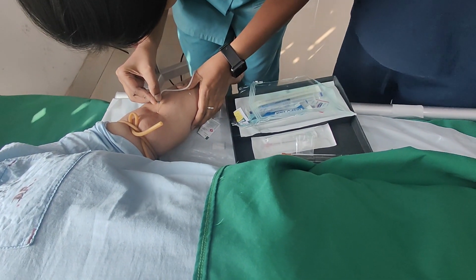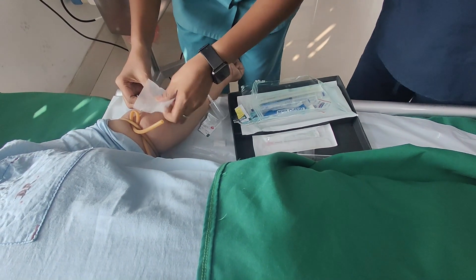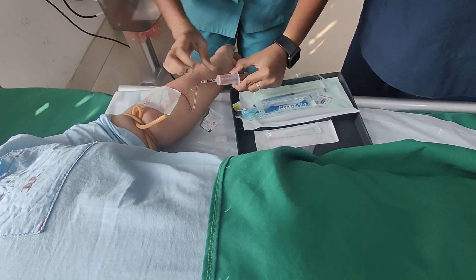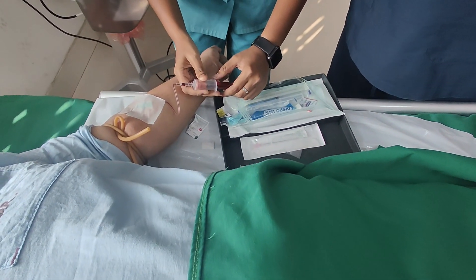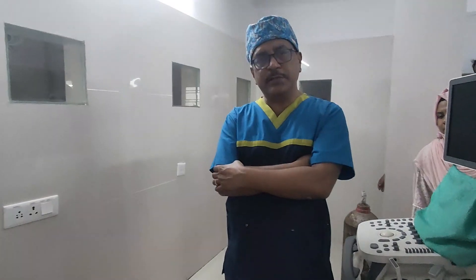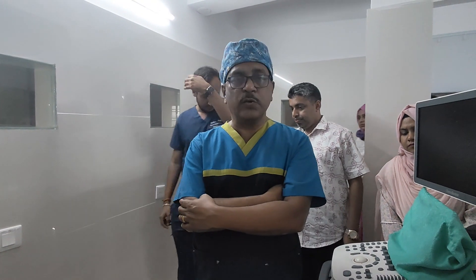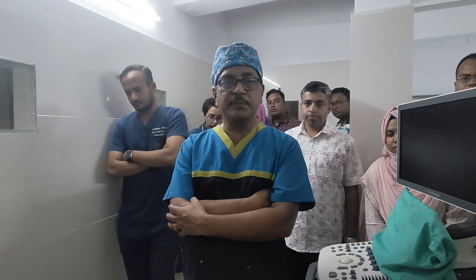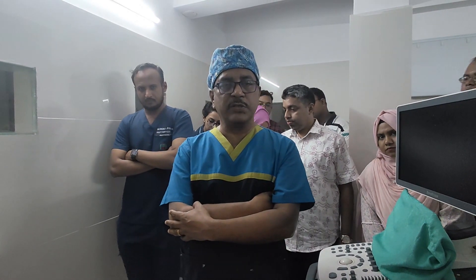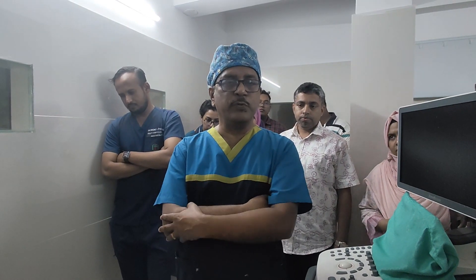Drawing the blood is just like any standard phlebotomy. There are many types of centrifuge machines available. Earlier people believed that temperature-regulated centrifuge machines are better, but those machines are costlier, and I say there is no need to use those machines.